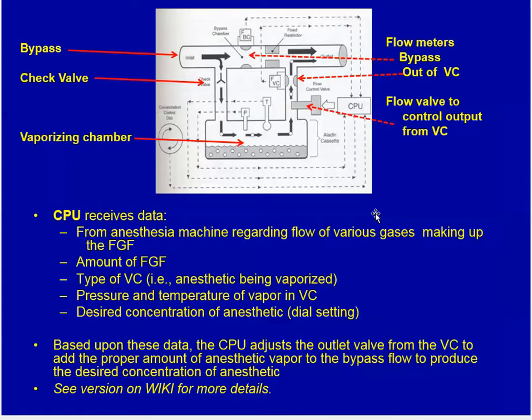Again, the computer receives the data about the fresh gas flow, the type of anesthetic being vaporized, the pressure and temperatures, and the desired concentration, and based on this data, adjusts the outlet valves so that it generates the percent saturation that you request.